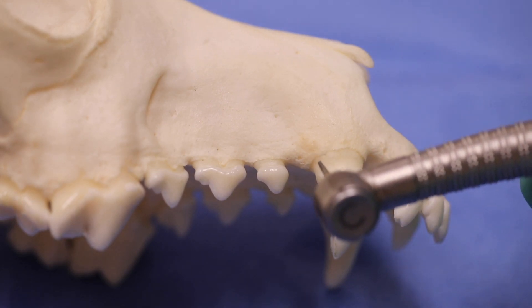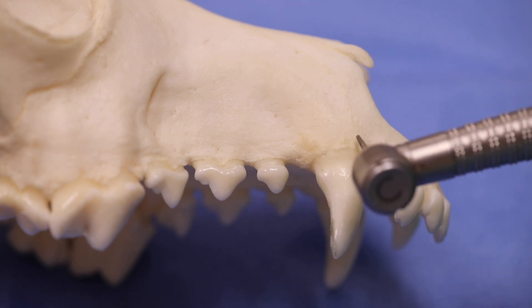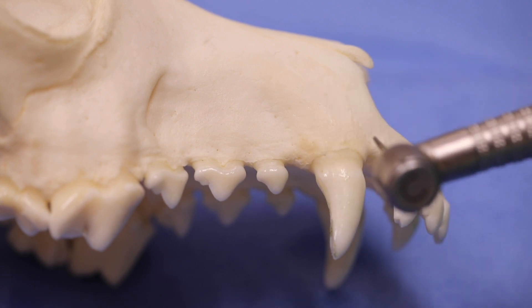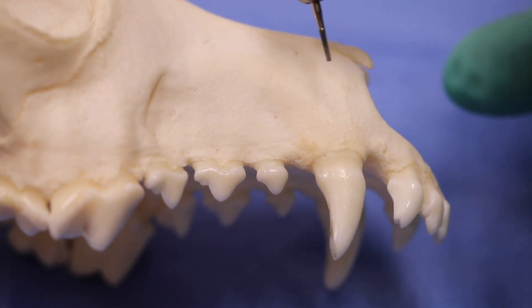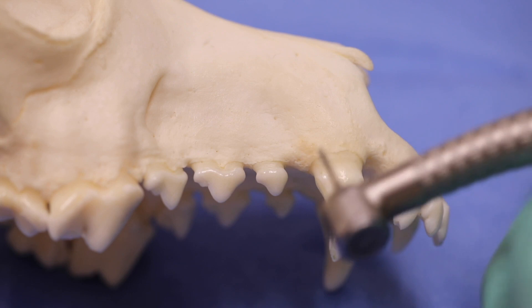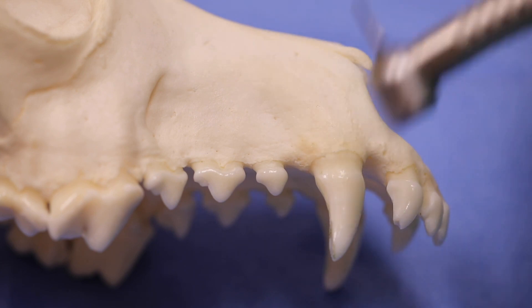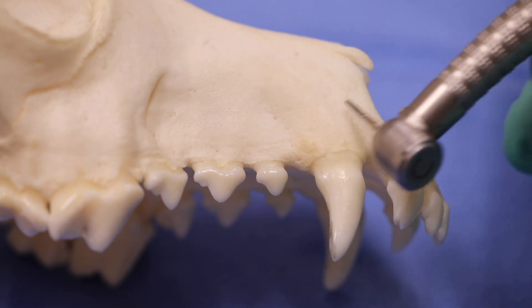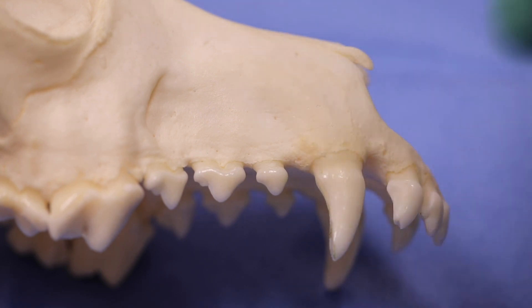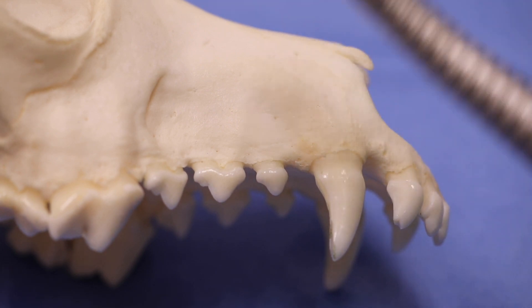An extremely important aspect of removing bone prior to making our grooves on the distal and mesial aspect is to be able to visualize the tooth-bone interface on each side, starting coronal and working apical. That's a big problem because as we go apical, it's more difficult to actually see that interface, and we tend to remove much less bone than we should be removing, especially up in this area and this area.